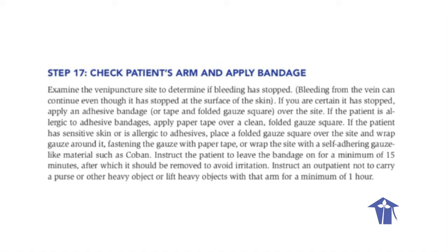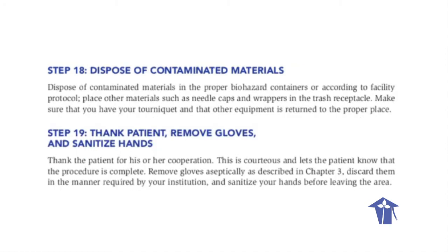If the patient has sensitive skin or is allergic to the adhesives, place a folded gauze square over the site and wrap gauze around it, fastening the gauze with paper tape, or wrap the site with a self-adhesive gauze-like material such as Coban. Instruct the patient to leave the bandage on for a minimum of 15 minutes, after which it should be removed to avoid irritation. Instruct an outpatient not to carry a purse or other heavy object or lift heavy objects with the arm for a minimum of an hour.